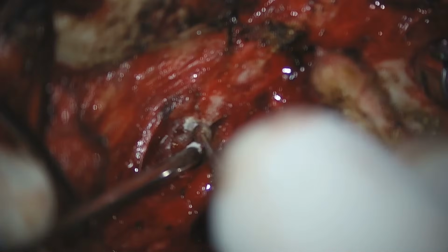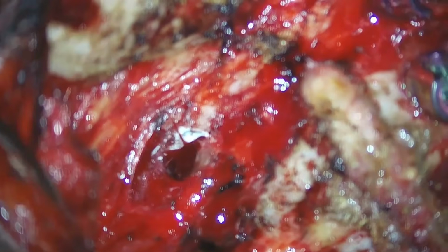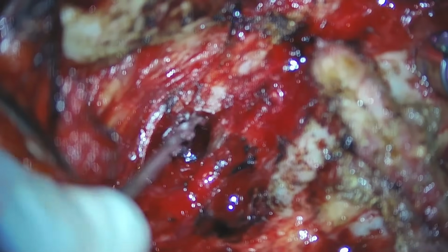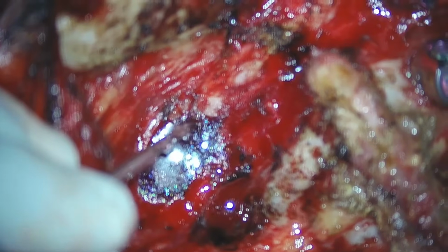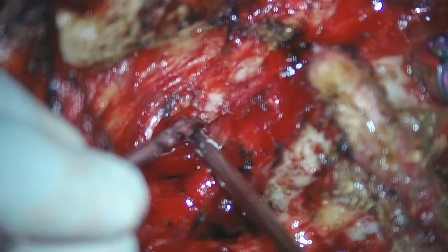Now we are using a handheld drill, and making way for the screw. In all these steps we can see slight ooze from the C2 venous plexus.